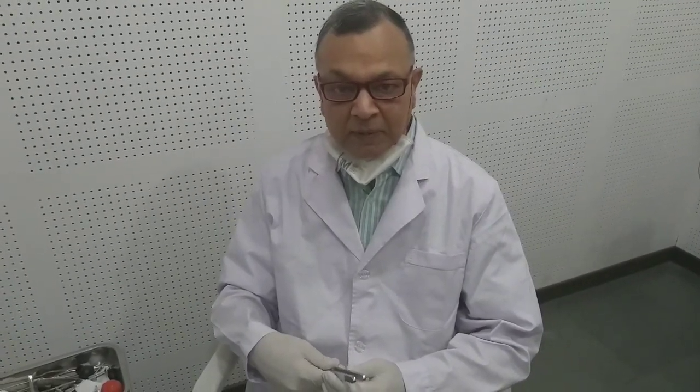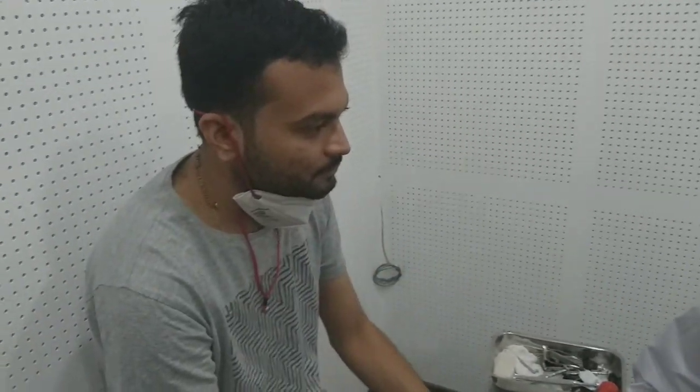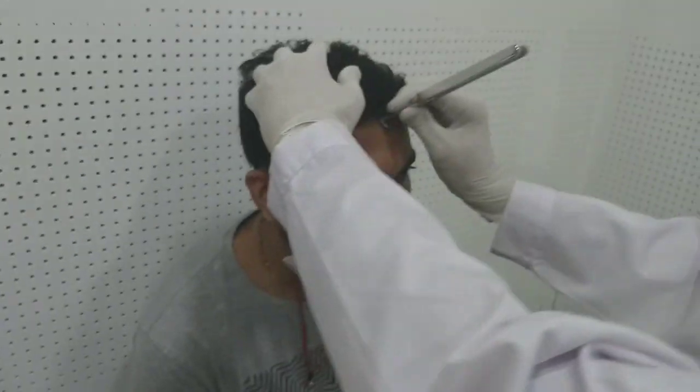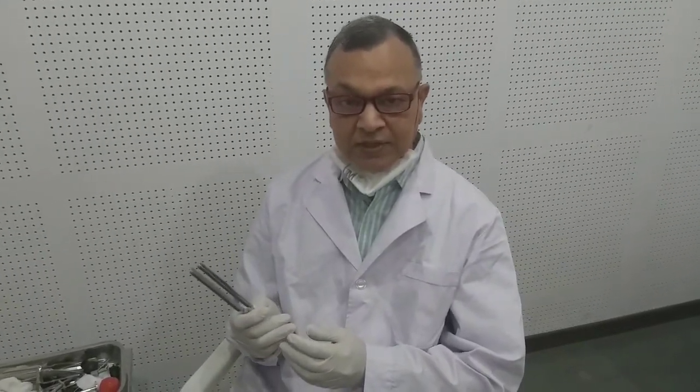Now we will demonstrate the Weber test. For the Weber test, we put the charged tuning fork in the center of the forehead or on the upper central incisors. Take out your spectacles and mask both. Can you hear? — Yes. On which side do you hear better? — Both equally. So in this case the Weber is centralized — it is not getting lateralized to any side.